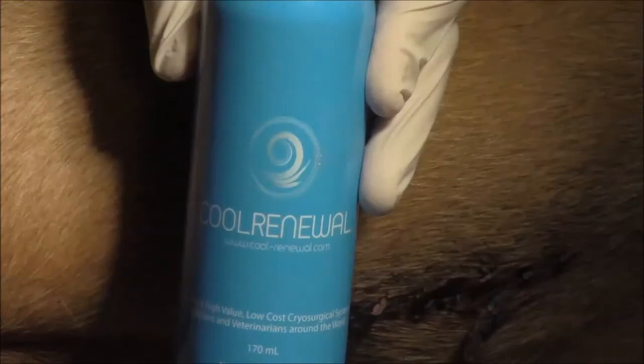You can see it here — it's a cryosurgery product. It's cryosurgery in a can; that's the best way I can describe it. I've done cryosurgery with liquid nitrogen before, and this presents a much easier way to get something done really quickly.